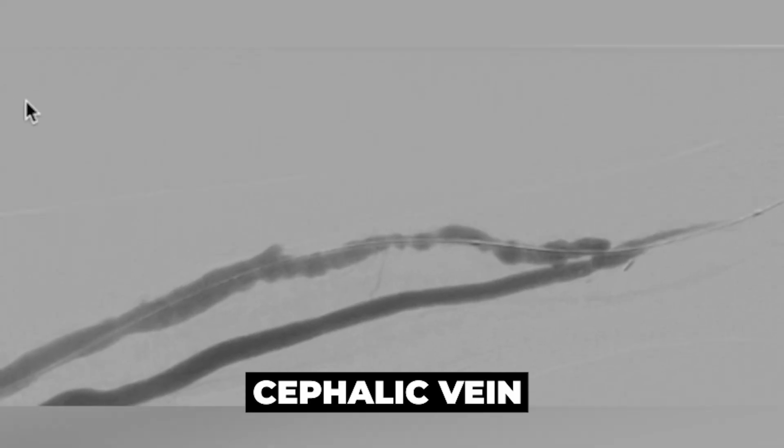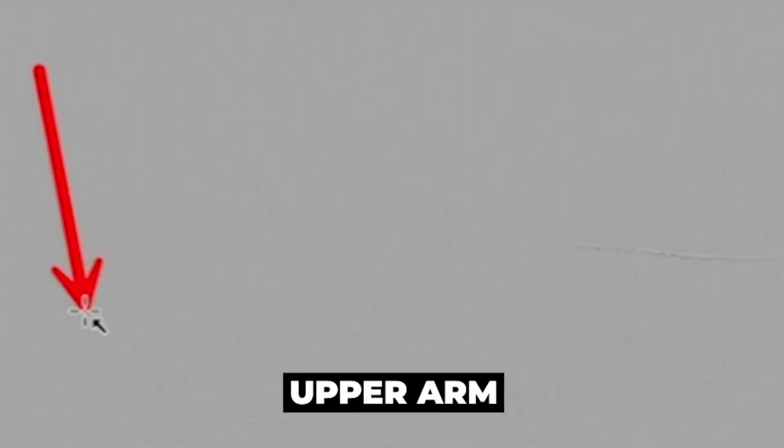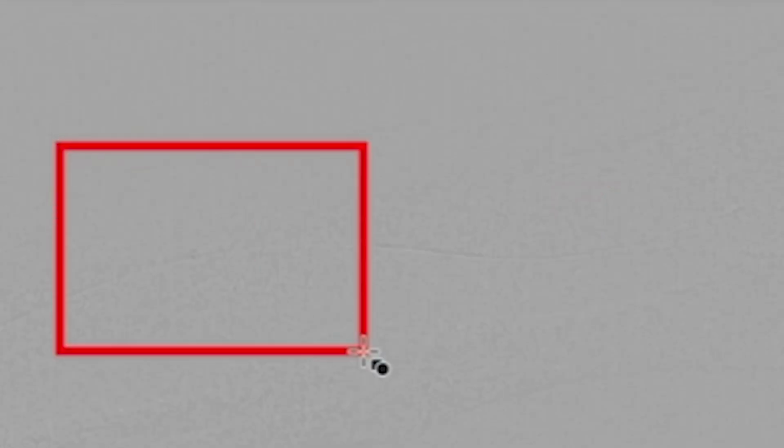We then get a second access in the cephalic vein, usually in the upper arm, to avoid spasm. And then we access towards the arterial anastomosis, which is again right here. And you can see this whole segment is pretty atretic, not developing.